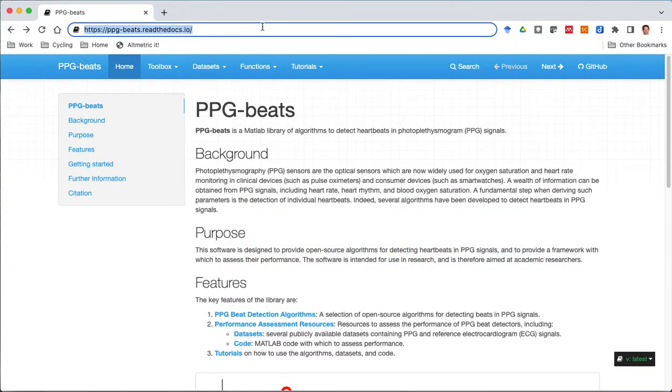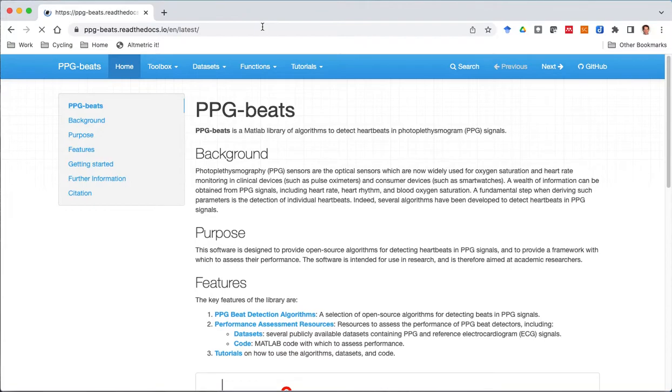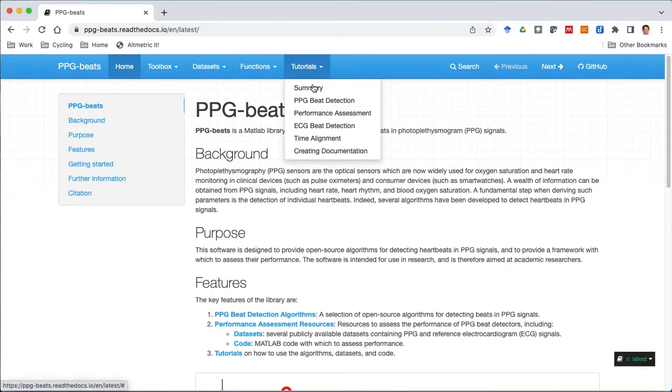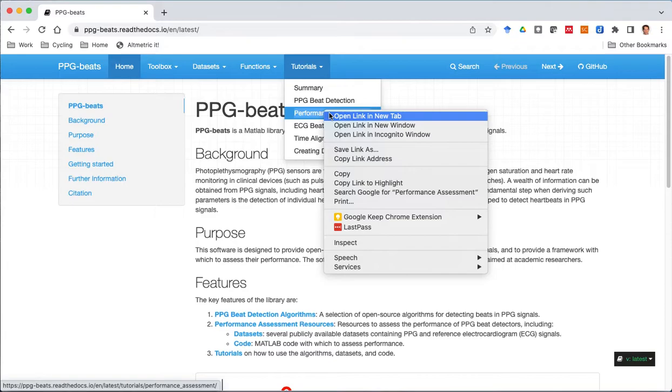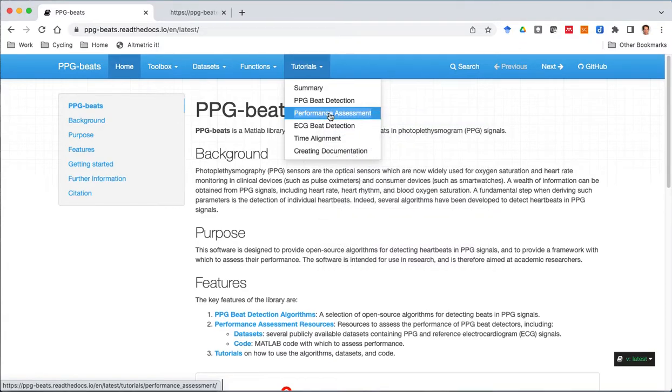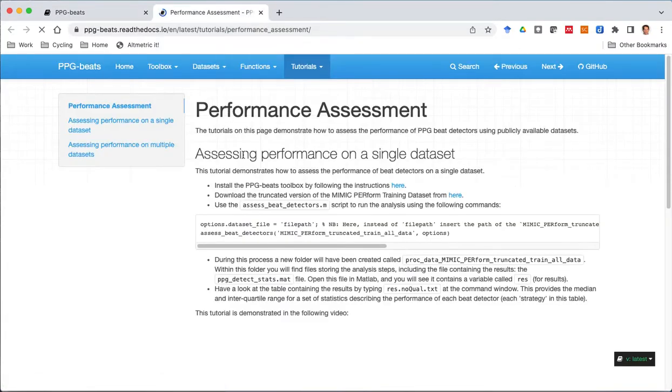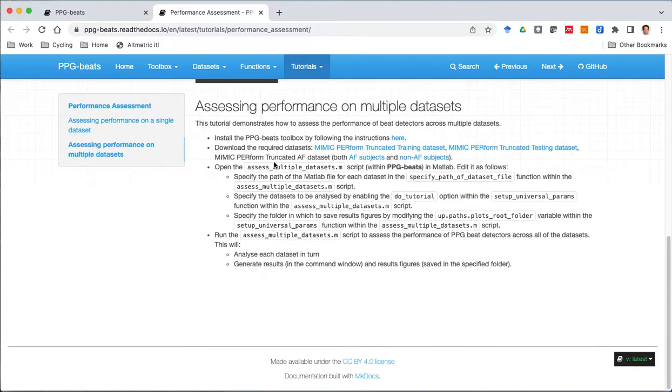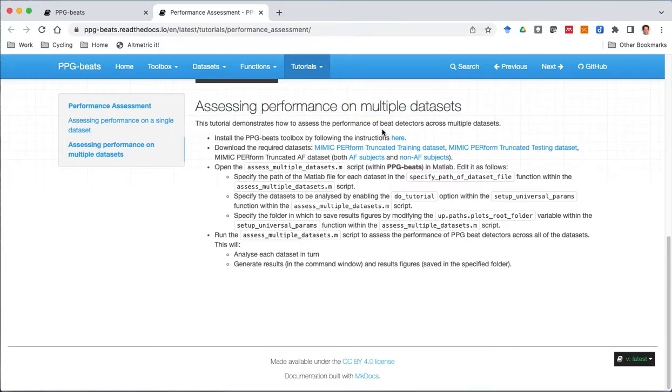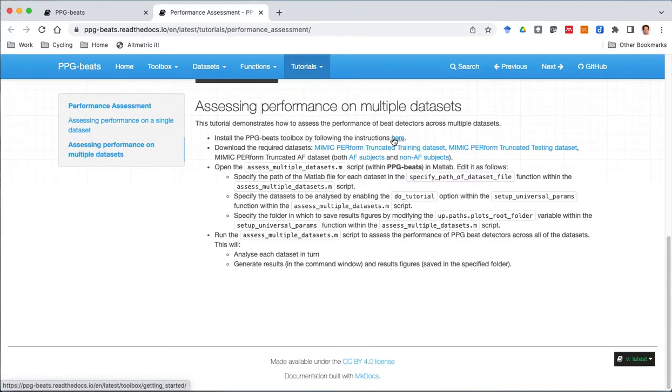PPGBeats.ReadTheDocs.io and we'll be using the second tutorial in the performance assessment category: Assessing performance on multiple datasets. We'll follow these steps and then have a look at the results. I'll assume that you've already installed the toolbox of algorithms, if not there are instructions here.